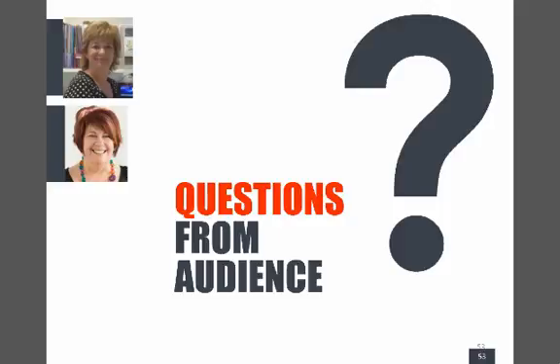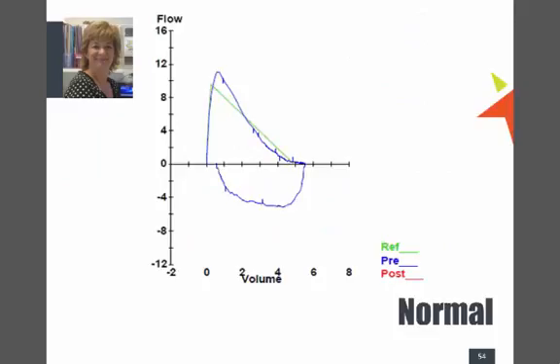What I tend to do is try to get them to take the big breath in, then put it in their mouth and make sure they've got a tight seal. I think it depends on the machine, and the only way you're going to get a proper answer is out of your machine's instructions, because some of the filters tell you not to do that. Okay, hopefully that's helpful. All right, so let's have a look at some spirometry, because that's really what you want to have a look at.